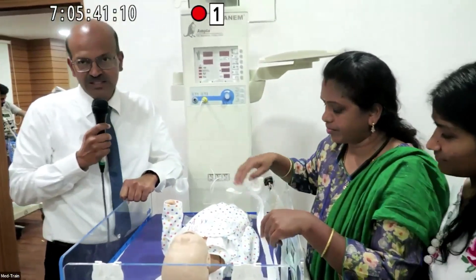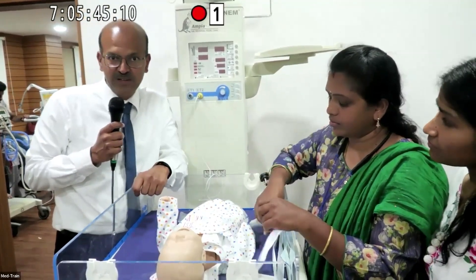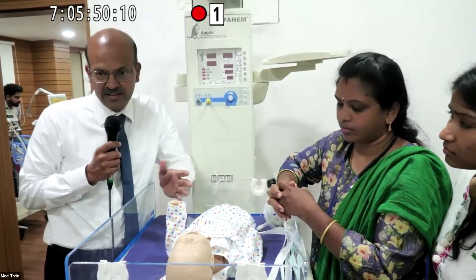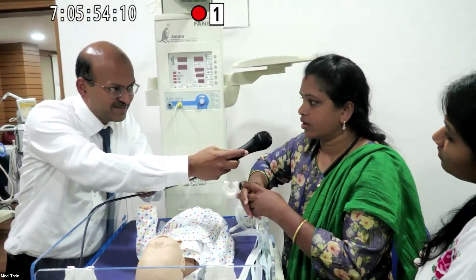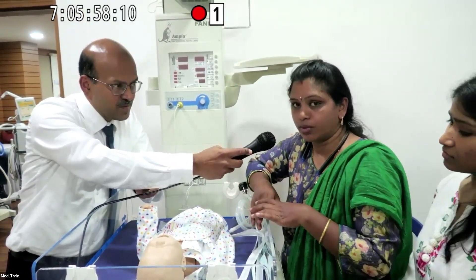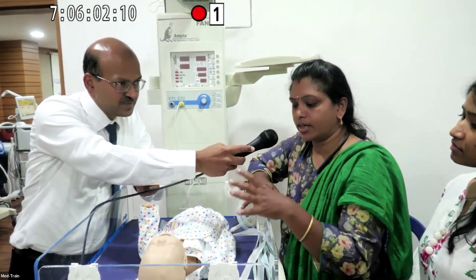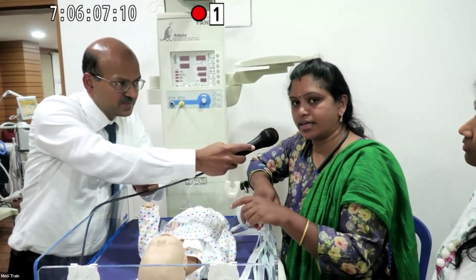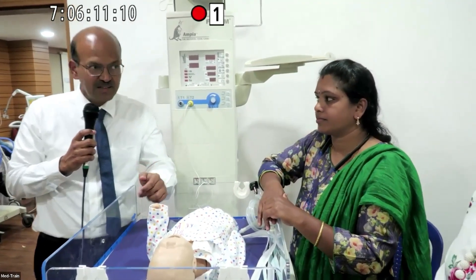Do suction only if essential. You can assess the need by looking at the expiratory flow scalar on the ventilator. If the baby is desaturating, retractions are increasing, and FiO2 is not helping, check for oral secretions or ET tube blockage through ventilator settings.